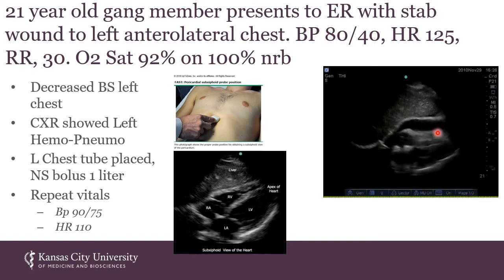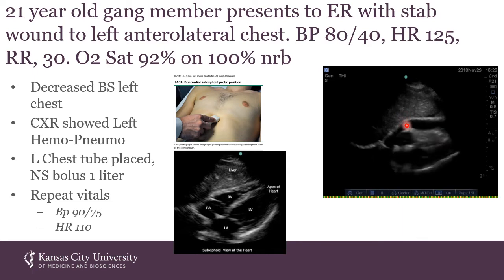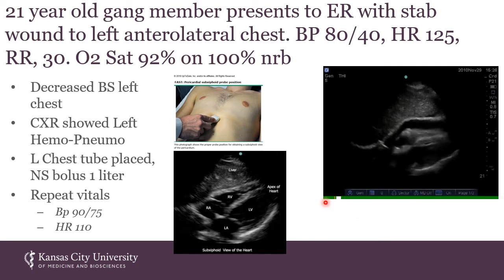Again, a big pericardial effusion, which is traumatic in this case. He'd actually lacerated his ventricle. And so he needed pericardiocentesis, a pericardial window, and a cardiothoracic surgeon. But I was able to sort that out pretty quickly from the time he arrived and get the cardiothoracic surgeon on his way to fix this guy.